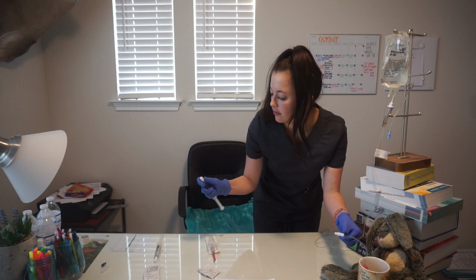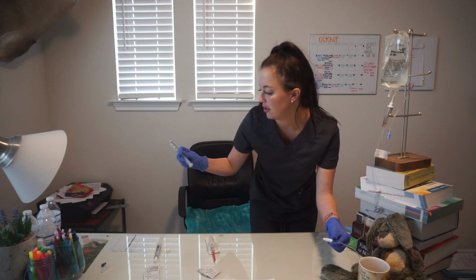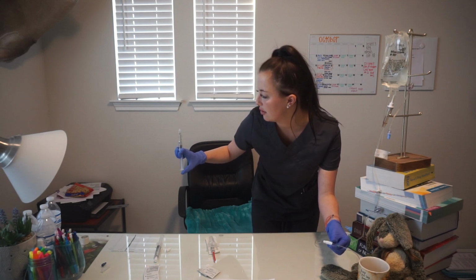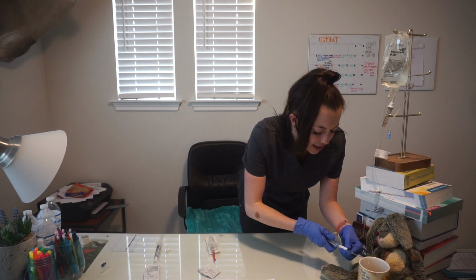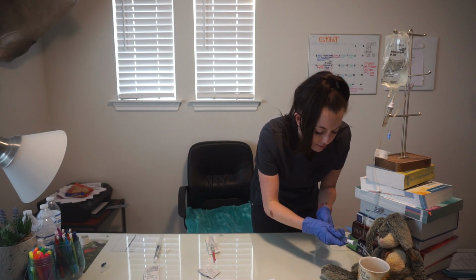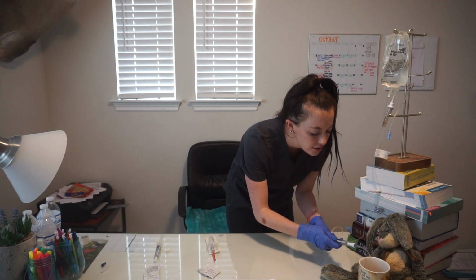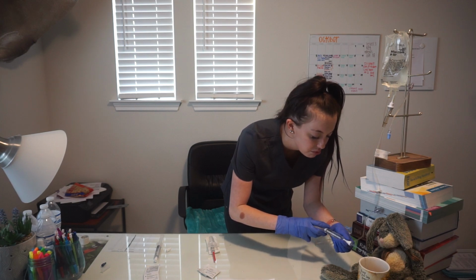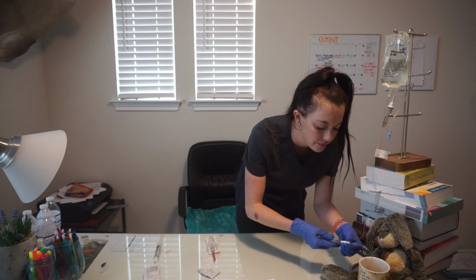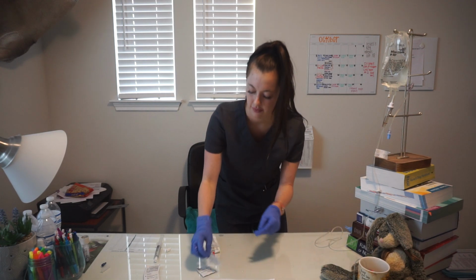Okay. Get rid of any air bubbles. There you go. Okay. I'm going to aspirate just to make sure I'm confirming location. I'm going to aspirate for blood return. Okay, there we go. And now I'm going to flush using the push pause method. There we go. Alrighty.